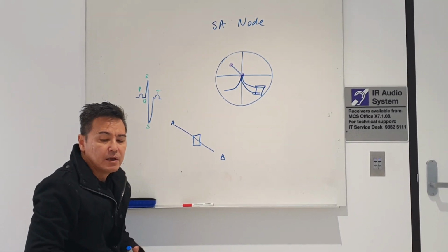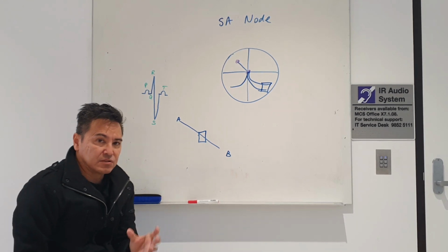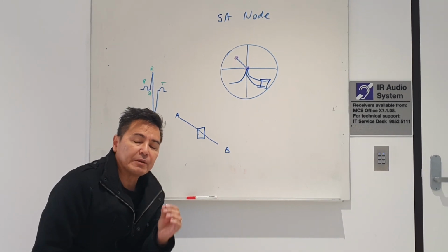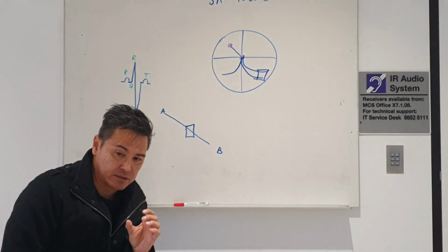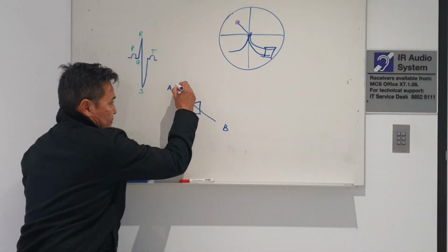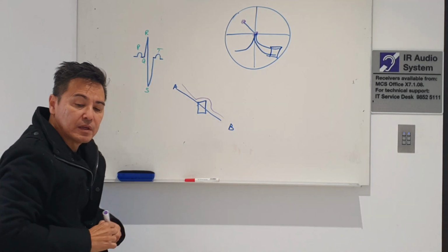and that's captured somewhat in an ECG. But what if I took a piece of cardiac muscle that died, just a piece of cardiac muscle, and now the cardiac muscle is dead? The ability to pass electricity through that dead cardiac muscle is altered, it changes. And the electrical current looks like this. It sort of does something like this, okay?